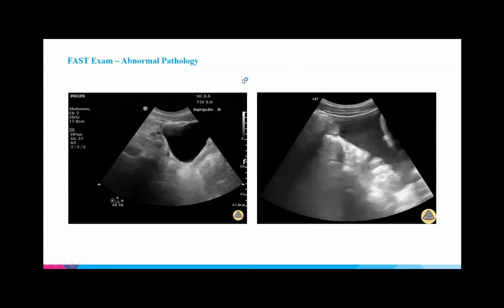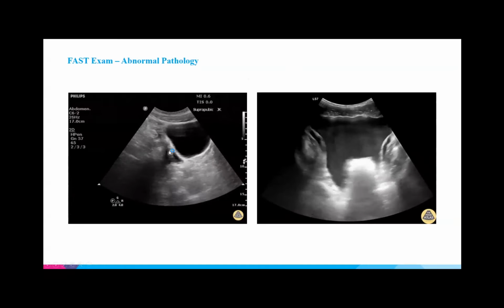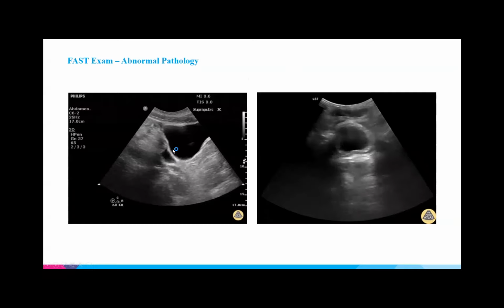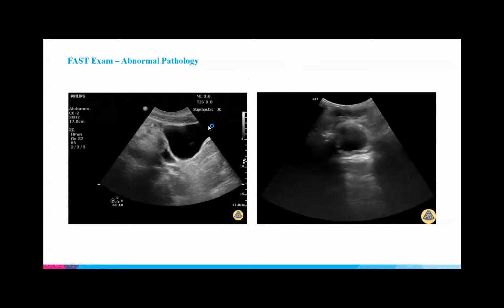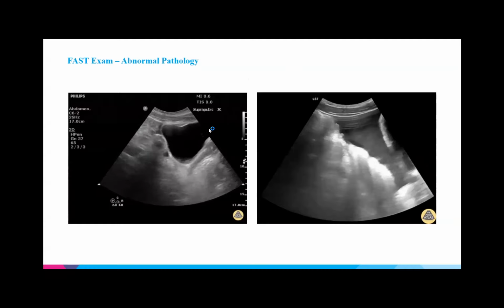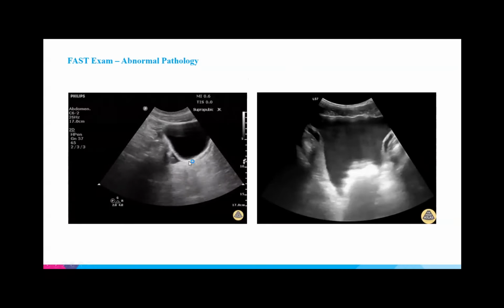This is just looking at the view of the bladder, okay? So then here would be a bladder right here, and you can tell that it's bladder and not just regular free ascites because the bladder has very thick walls, right? So there's thick walls that are separating it, and it sometimes looks square, sometimes looks trapezoid, depending on how distended the bladder is. I guess in this case, it almost looks triangular, but kind of trapezoid-esque.